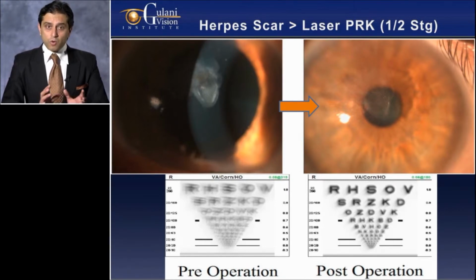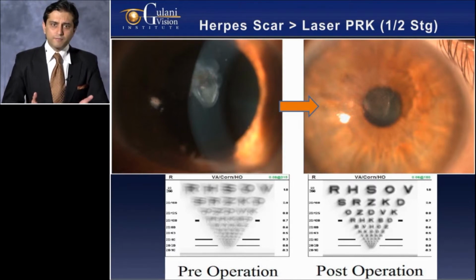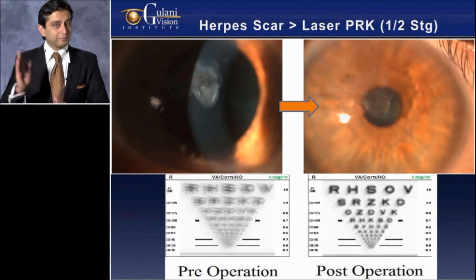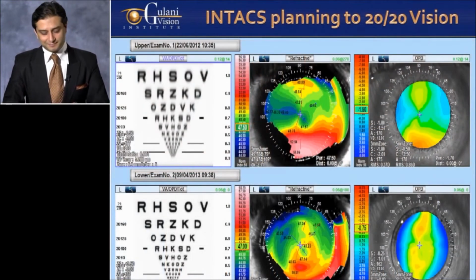And now you can actually quantitate why this patient is thrilled, because to me, he's still not 20/20, he's 20/50. But he's thrilled beyond belief because his quality improved. And you can also confirm that with technology using the OPD and say, okay, now I understand why you're so happy. And from here, you also understand another element in this gentleman, because he was in his late 50s, is maybe down the road he'll need cataract, and that internal OPD is something we'll tackle at that time.